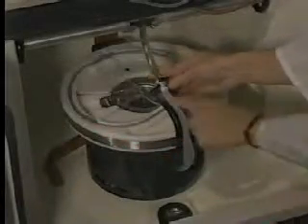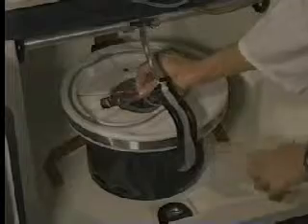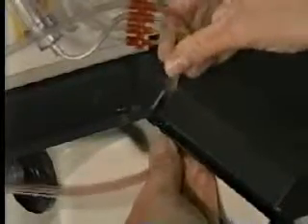Inspect all lines to ensure that they are not kinked. Place the tubing in the exit slot on the right side of the system using a flossing action. Rotate the centrifuge in a clockwise direction several times to ensure that the tubing is secure and does not twist. Both the upper and lower bearings should also remain in place.